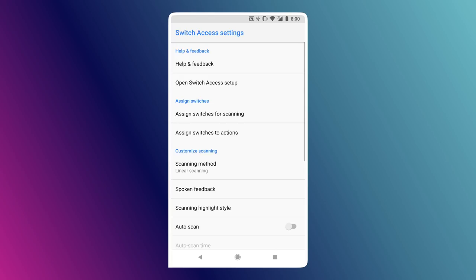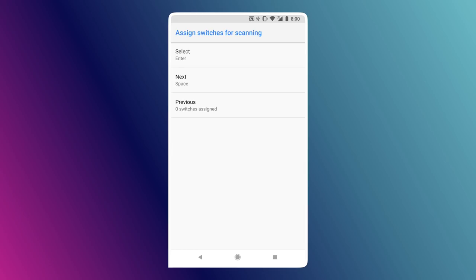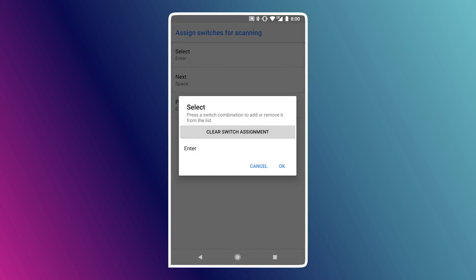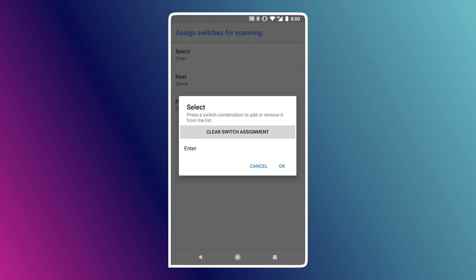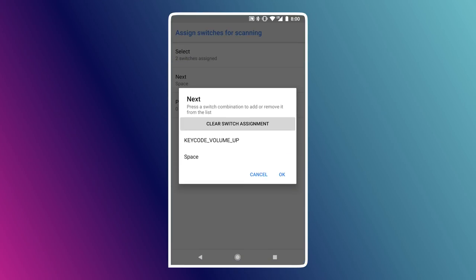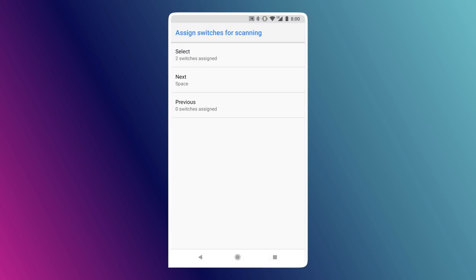I'm going to go over to where it says Assign Switches for Scanning, and for Select — which is essentially a mouse click — I can click on that. I've actually already mapped that action to this yellow button right here. But if you don't have a switch device, you can still test this on your phone by using the volume keys. For instance, I can use the volume down key on my phone and assign that as a switch as well.